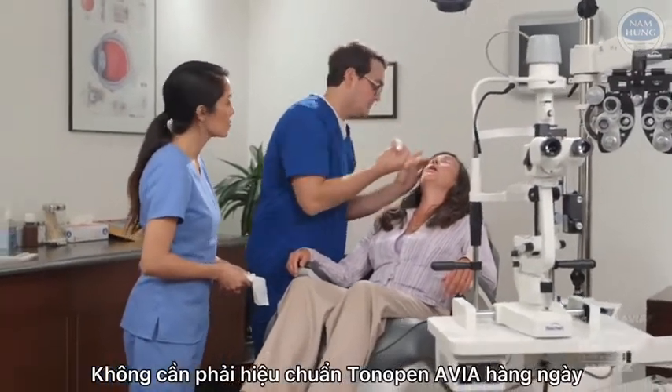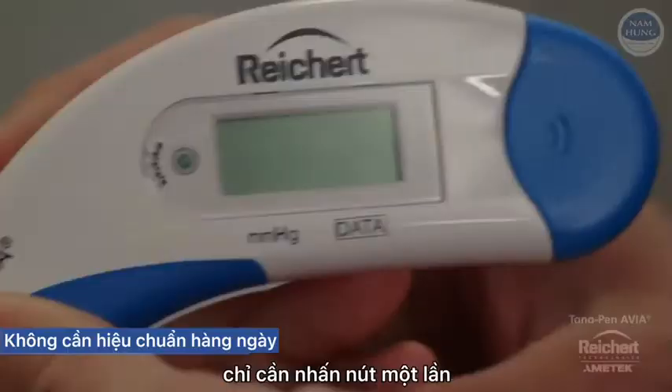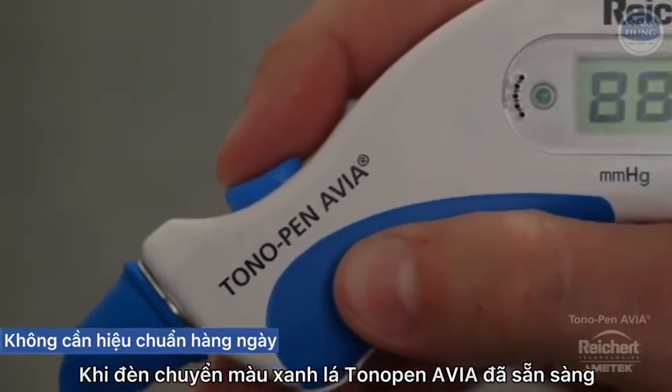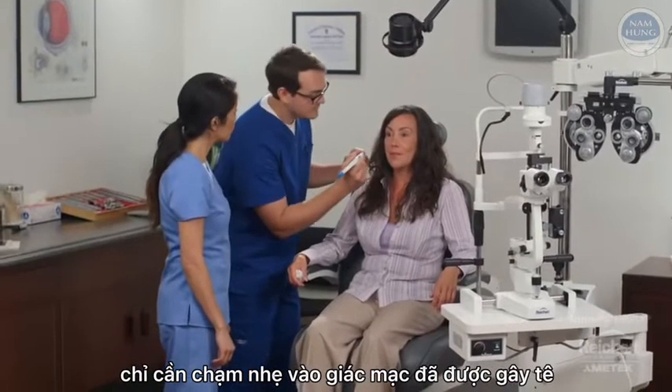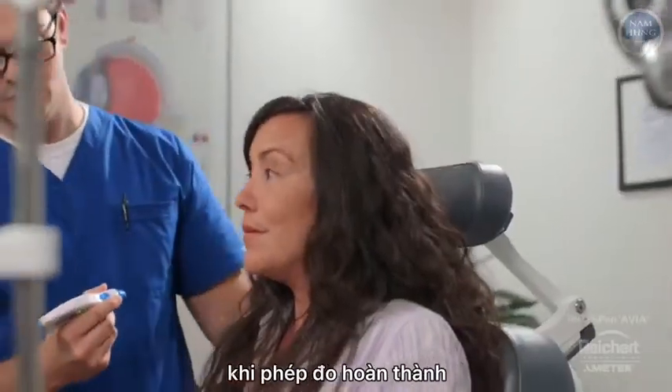Routine calibration of the Tonopan Avia is not required. To make a measurement, simply press the button once. When the light turns green, Tonopan Avia is ready to go. Gently tap the anesthetized cornea. A beep will sound to alert the operator when the measurement is completed.